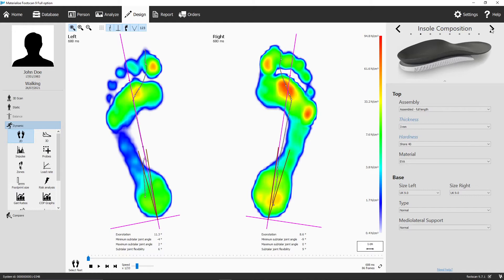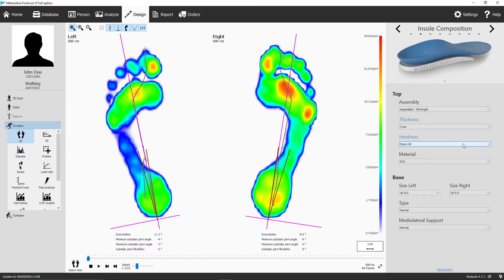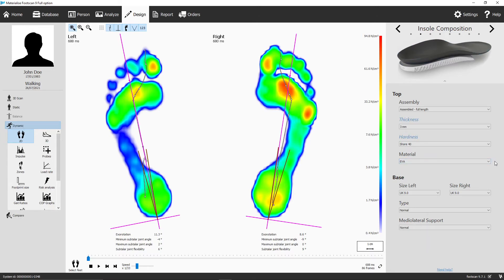In the second panel, decide the top cover characteristics and change some general properties of the printed base part. Choose how you want to assemble the insoles, how thick the top cover should be, in what shore value, and whether you want to add a synthetic finishing layer or not. Note that the thickness and the hardness of the top cover are suggested based on the patient's weight and the selected usage in the first screen.